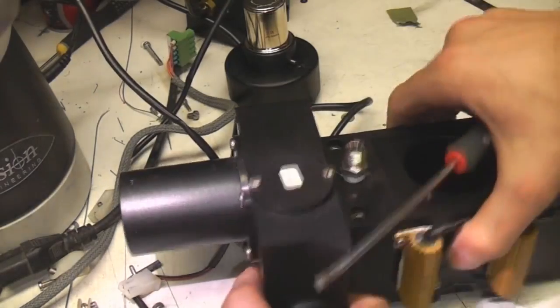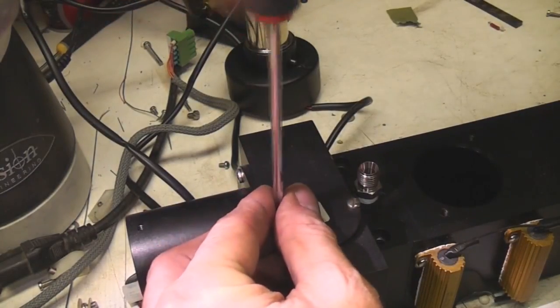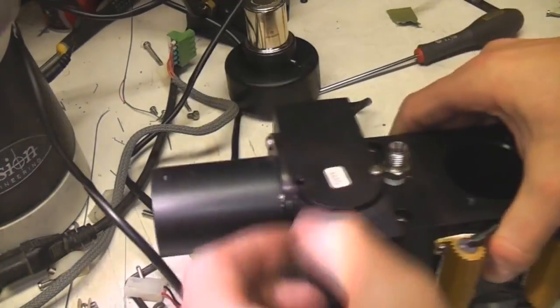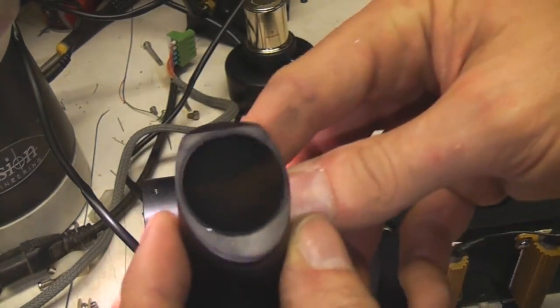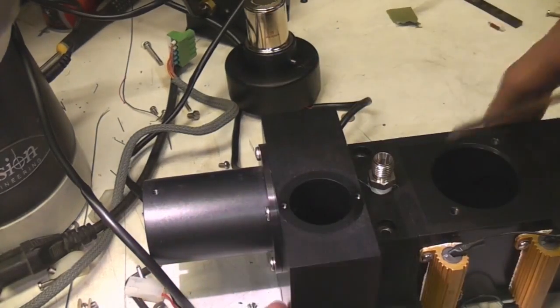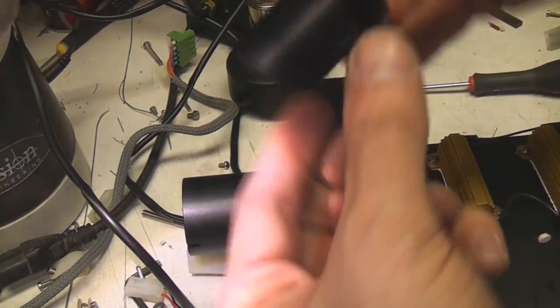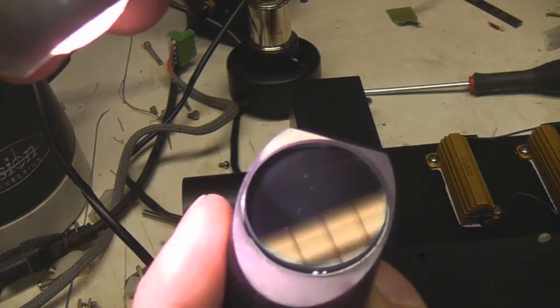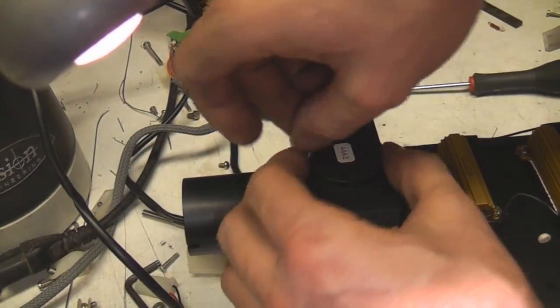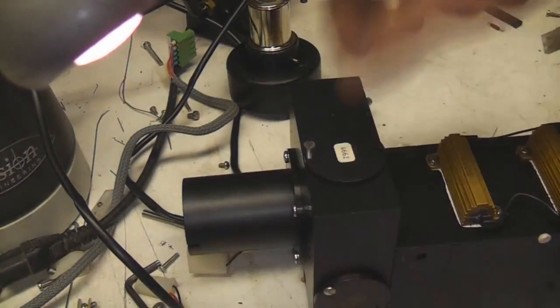There seems to be four sections here - maybe those are filters or mirrors or something. There's no other electrical connection so it doesn't look like there's a shutter. Yeah these are mirrors and they look like they've got some sort of coating on them. These are probably designed to reflect specific wavelengths. You can just see the edge of the coating - I'm guessing these are probably designed to reflect or absorb specific wavelengths as it goes in and bounces around four ways and then goes out into the main reaction chamber.